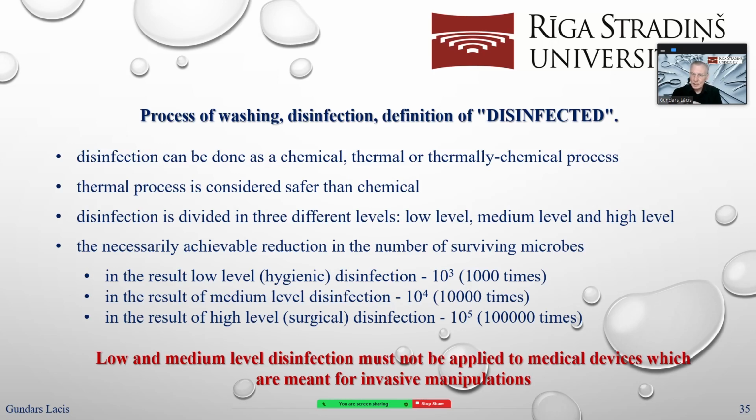When we are proceeding with disinfection chemically, we have three possibilities. One is immersing, the second is spraying on, or the third is swabbing with a disinfectant swab. All those three possibilities have one common advantage. It's low temperature. Even at 20 degrees, we may try to disinfect and maybe we will reach some result. But all those three possibilities have their own disadvantages.